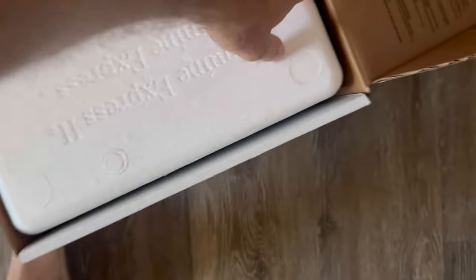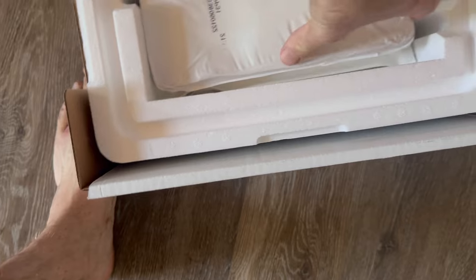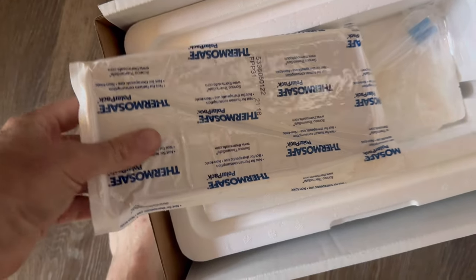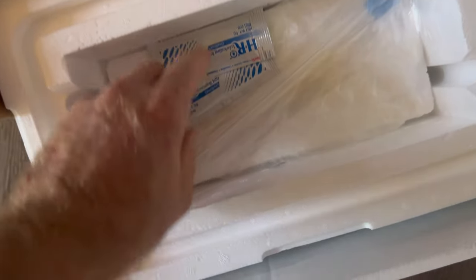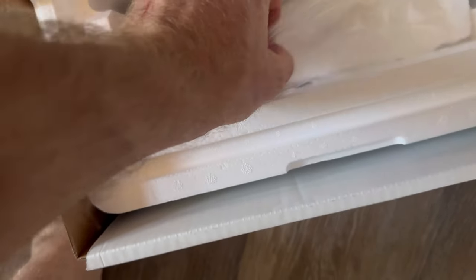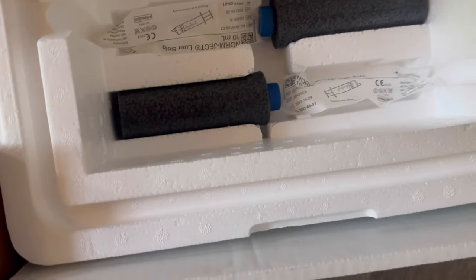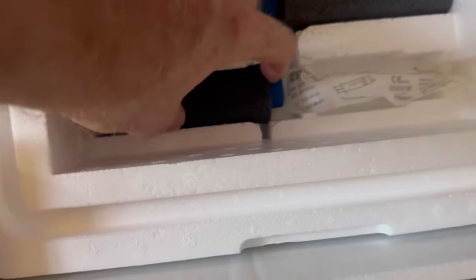Nice thing to keep it chilled. This is like an ice pack. You got your alcohol wipes, and you got styrofoam — each one of those things has a styrofoam.